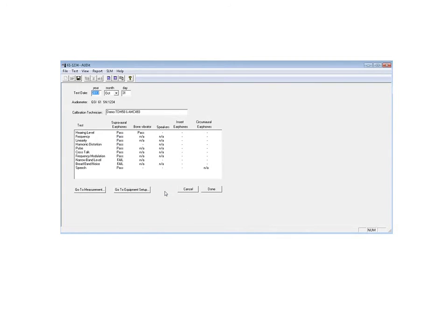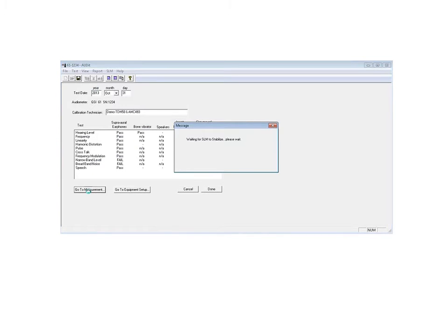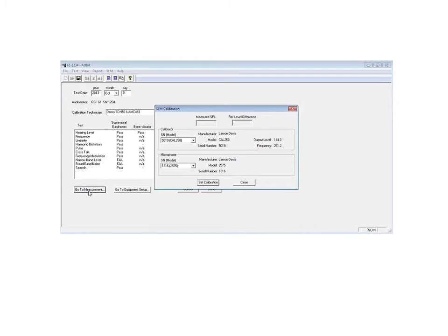So now we can go to the measurement. Right now the audit software is setting up the 824 sound level meter to the proper mode and gain and settings.